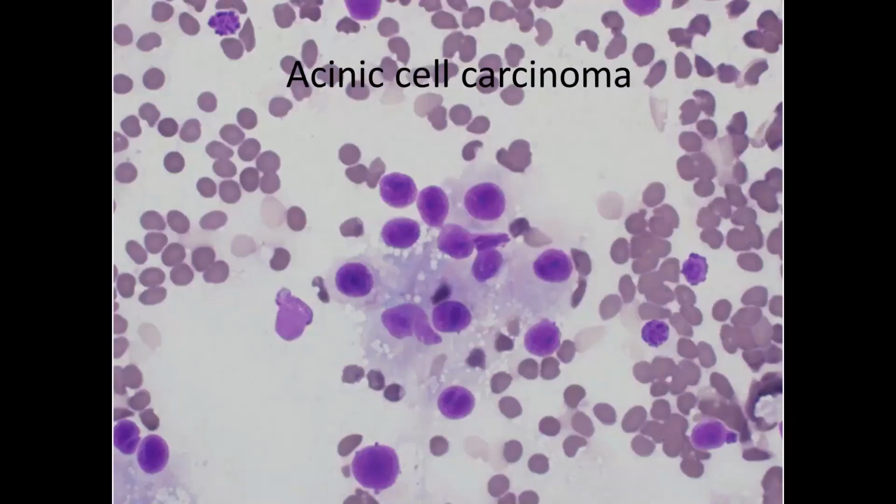At higher power, you can appreciate that in contrast to an oncocytic tumor or a Warthin's tumor, there's going to be more nuclear atypia. Again, you still get nucleoli, but the nuclei are bigger, the nucleoli are bigger, and the nuclei tend to be a bit coarser, so more nuclear atypia than those oncocytic tumors. Also, the cytoplasm tends to be granular, but tends to be more coarsely granular. You can appreciate the granularity better in the diff-quick than you can with those oncocytic tumors. And finally, you usually have a combination of both granular and vacuolated cytoplasm. So we have nucleoli, we have atypia, we have coarsely granular as well as vacuolated cytoplasm.